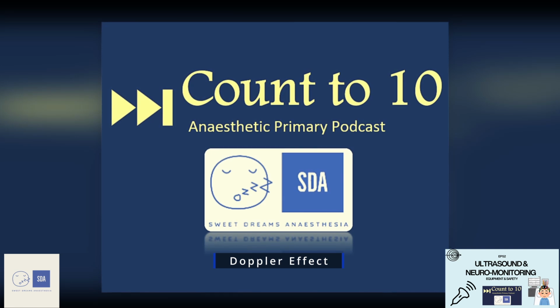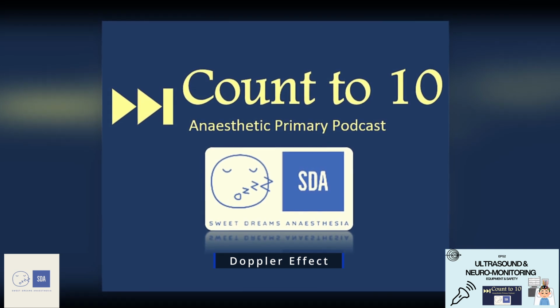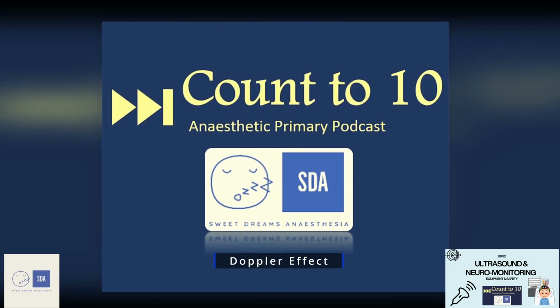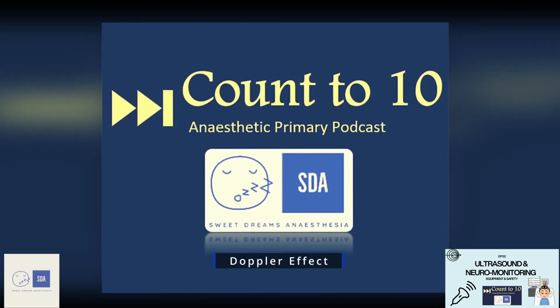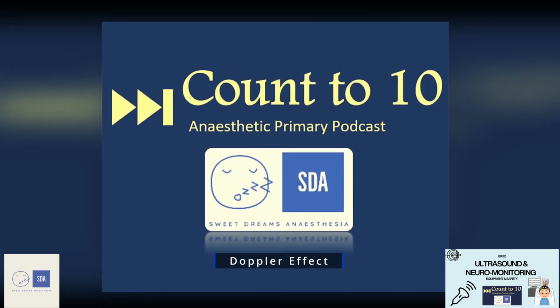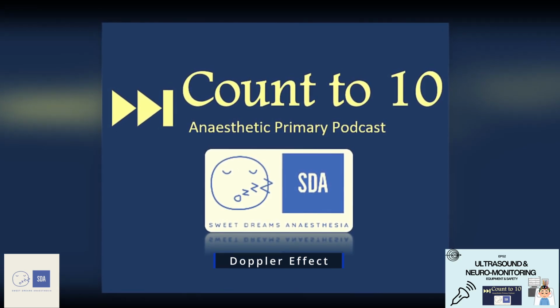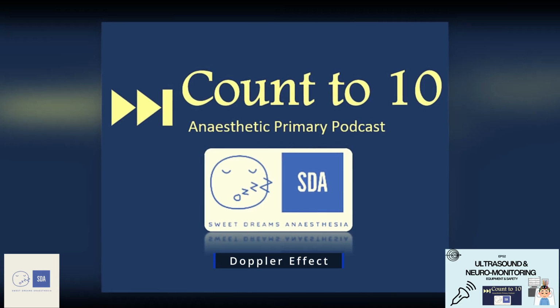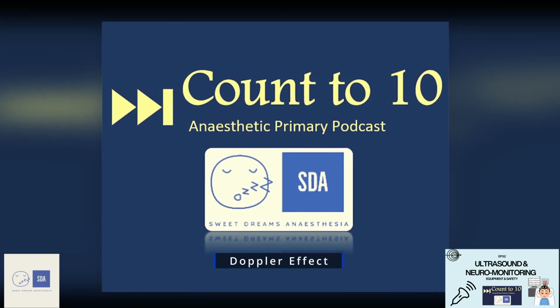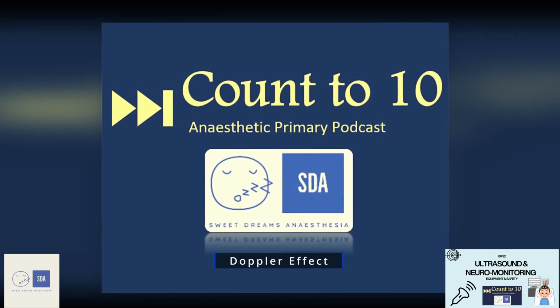And if you're concentrating all the piezoelectric crystals across a single scan line, you can generate a really detailed image which can show even the fine granular movements. That image is scaled across time, where time is the x-axis and the image itself is the y-axis. And these modes are really useful when we're trying to look at specific structures in small details, like when we do lung ultrasounds or when we do cardiac ultrasounds, either looking at the valves or even looking at the thicknesses of the ventricles, which allows us to get outputs like fractional shortening.